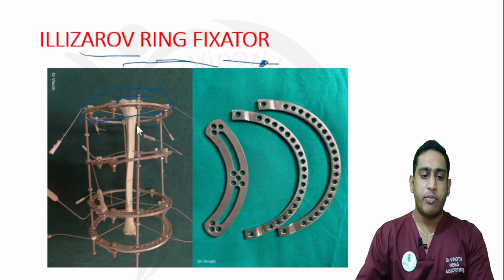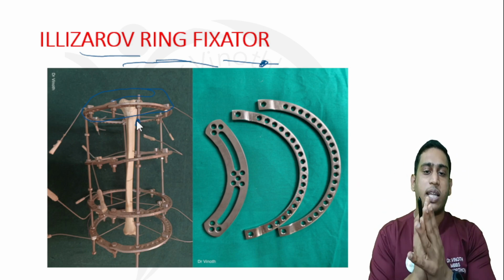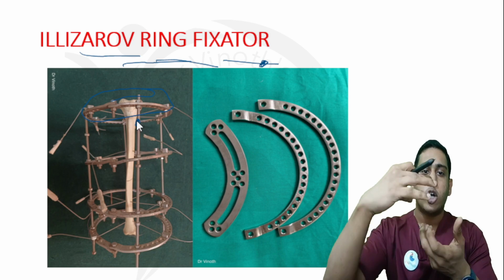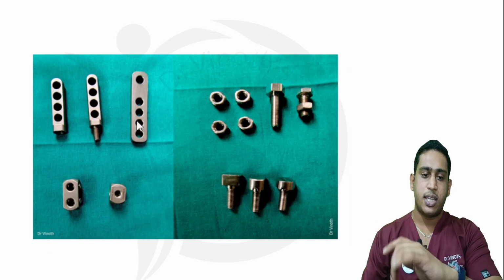This bead will be lying outside the bone surface, and they are used for alignment or compression. They will be having a better hold to align the deformity at the fracture site. So these are the components.